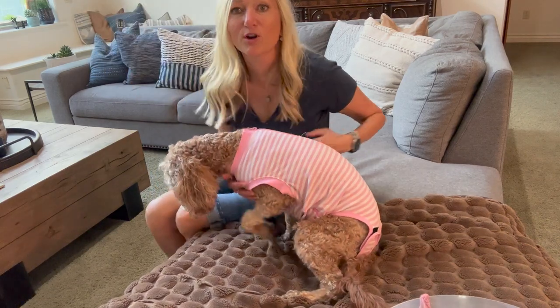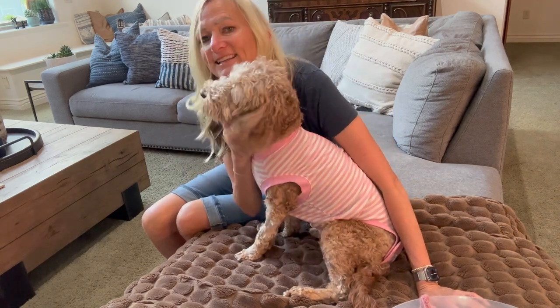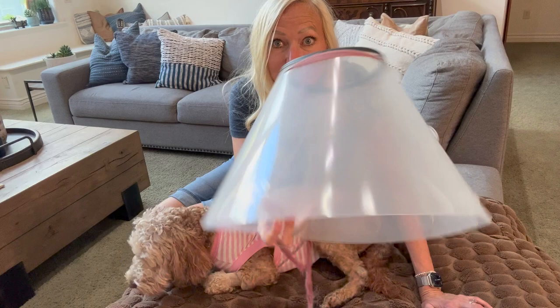This has worked so well and we can avoid wearing the cone entirely. Doesn't she look cute in it? It's just like a little onesie. I would rather have Coco wear this, and I know she would rather wear this than that big cumbersome cone.